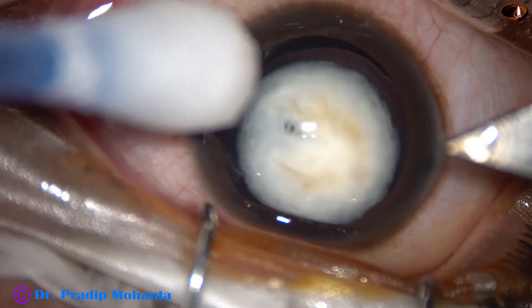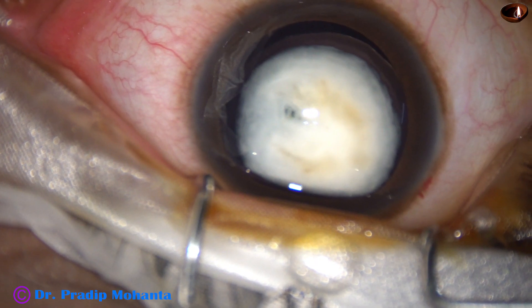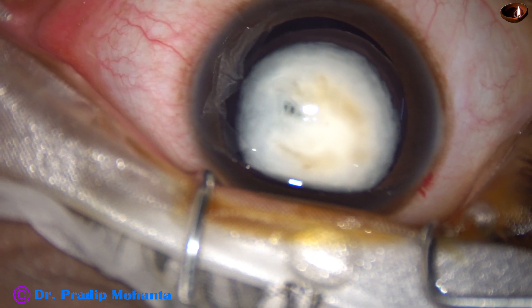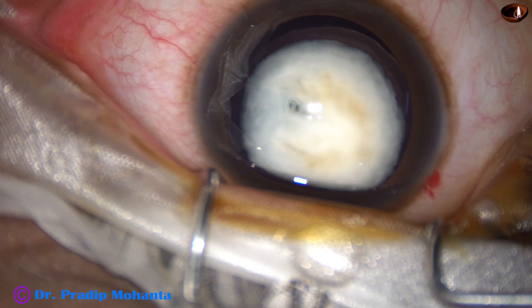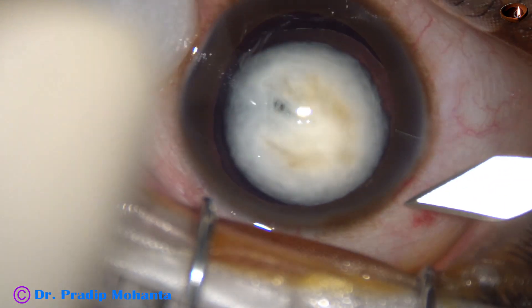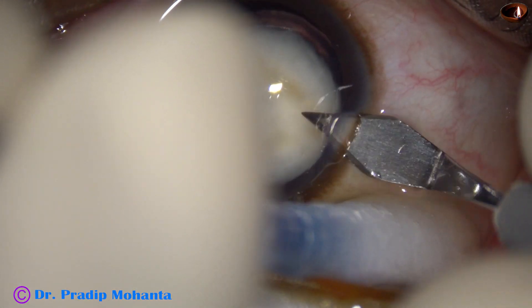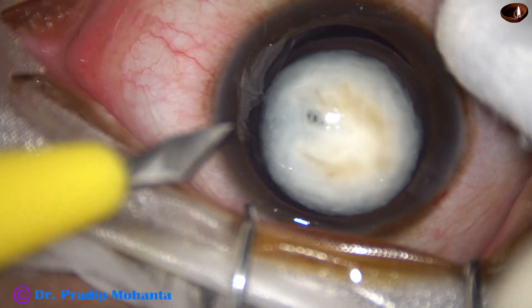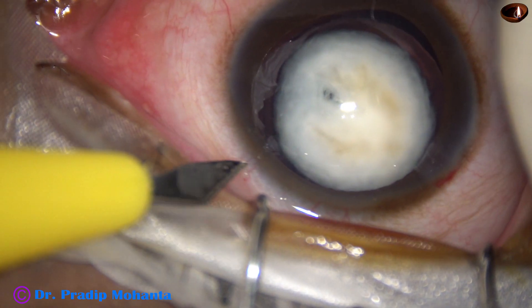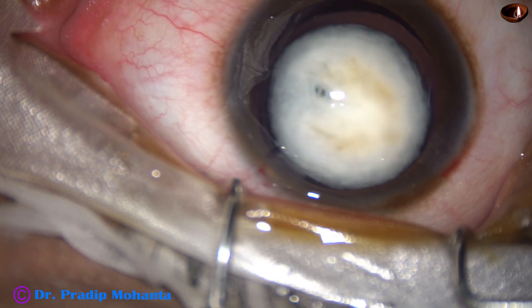Let us observe this surgery. This is the main incision on the posterior aspect of the limbus. If we place the incision on the posterior aspect of the limbus and include a little bit of conjunctiva, the need for suturing the wound is minimized. This is a 2.8 mm posterior limbal incision. And now I made one side port, about 3 clock hours away at around 2 o'clock. The main incision is at 11 o'clock.